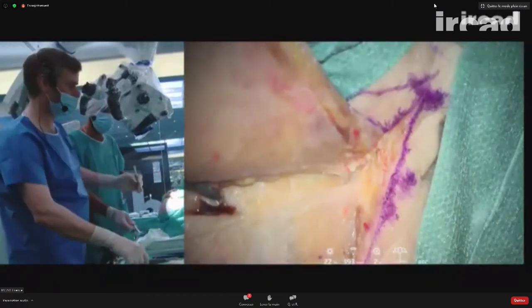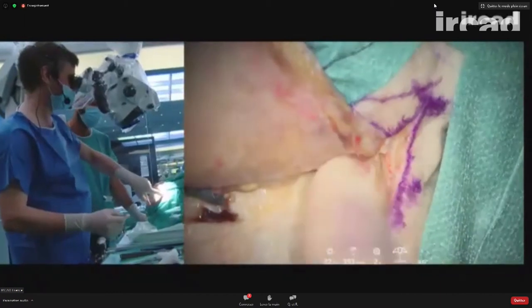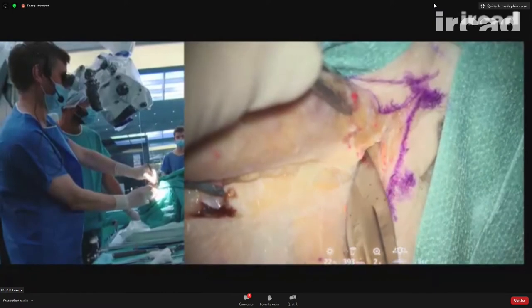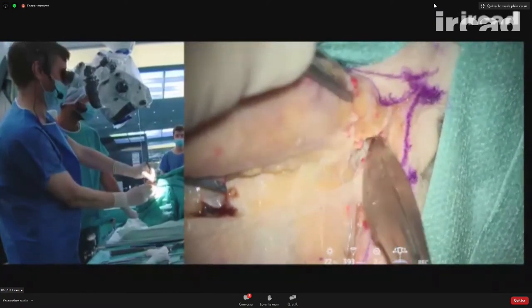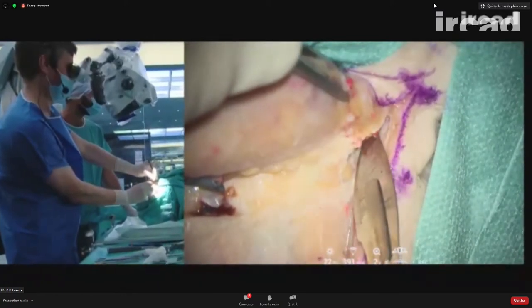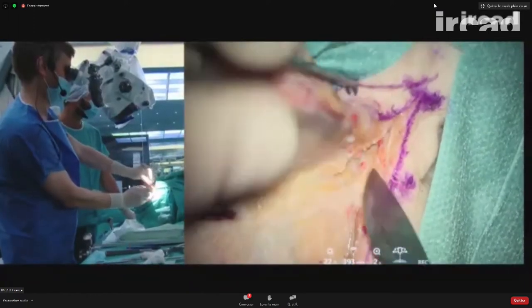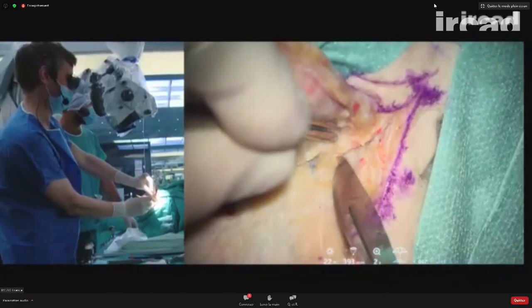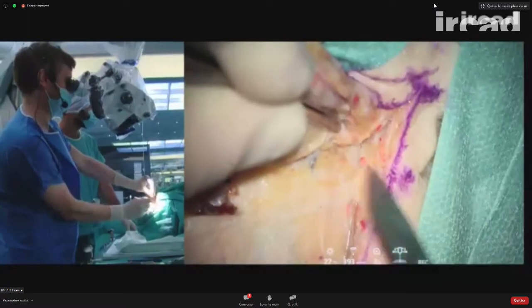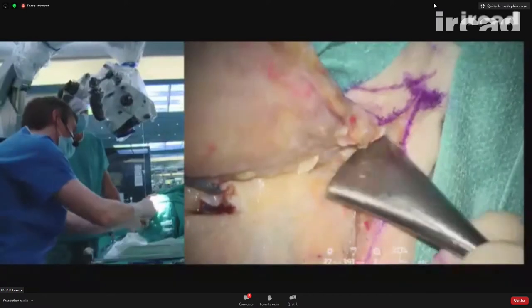We can see the tragus here. I can feel the zygoma. And I can make an incision here, quite posterior, until I reach the zygoma, which is here.